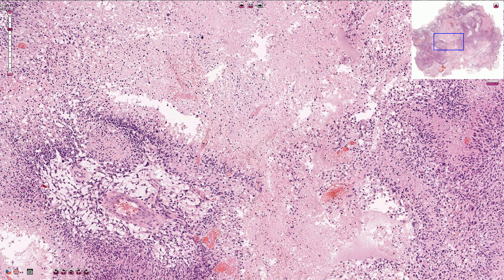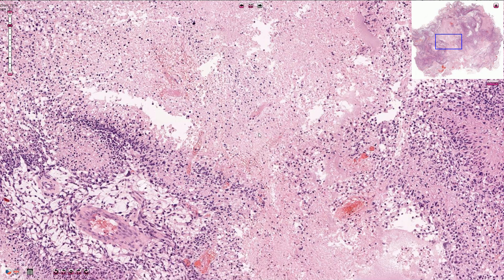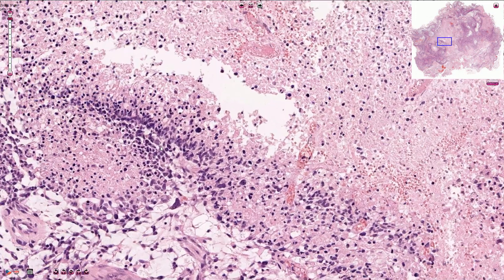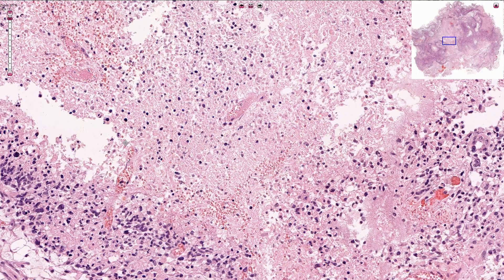Here we have the necrosis on a higher magnification with nuclear loss and viable tumor here. The border between the tumor and necrosis is typically associated with the so-called palisading of the cells, where the tumor cells are arranged perpendicularly to the border of the necrosis.